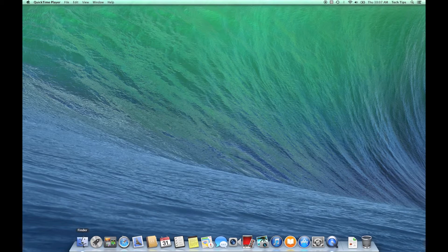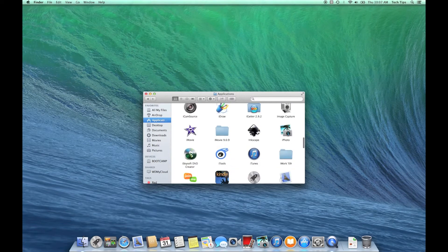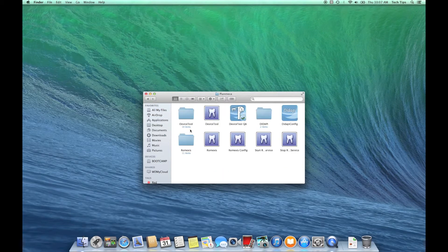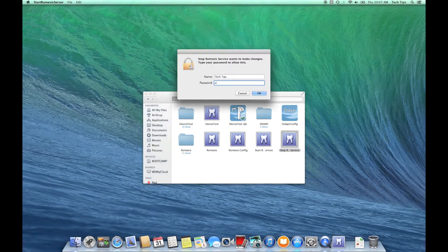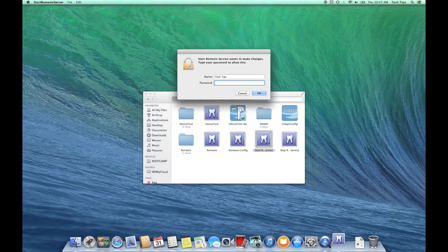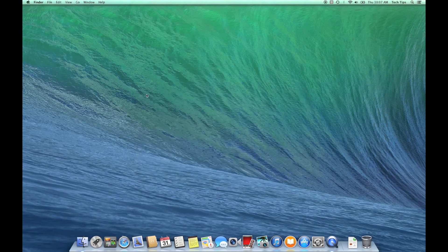To wrap up the installation, navigate to the applications folder and find the PlanMeka folder. We're going to stop and then restart the Romexis service, which will cause the computer to look for that license again. Here's the start Romexis service icon and the stop Romexis service icon. Double-click the stop Romexis service icon to stop it, type in the password, and hit okay — it stopped. Then restart it, type in the password, okay — and there we go. The Romexis service has started and the license is installed.